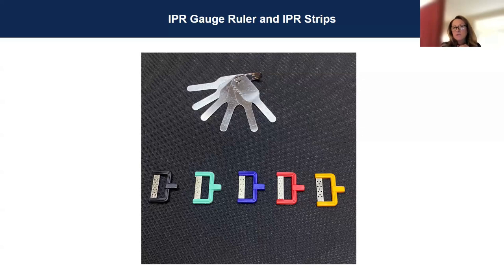But these gauges go by the number, and as for the disc, the lighter colors are usually the finer ones. My doctor will usually start with the finer one, even if there's more to remove, then go to the rough one, and then go back and smooth and polish with the finer one.